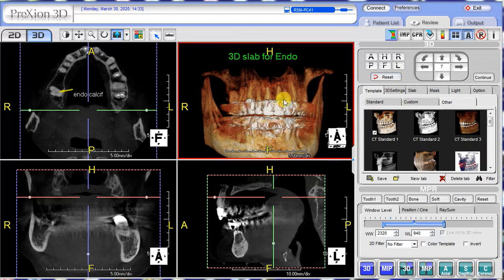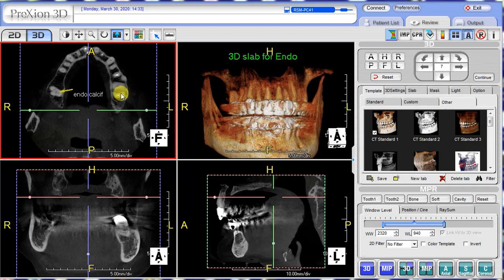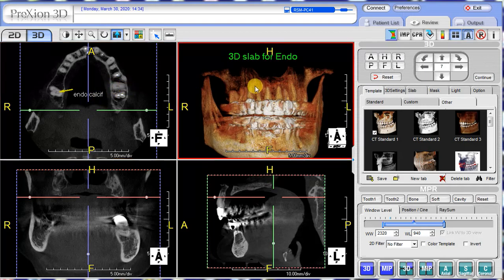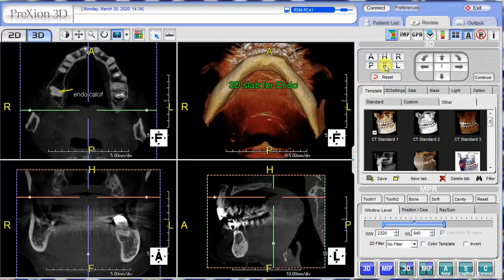Put the 3D in a foot projection, which is similar to what you see on the axial screen from the CBCT image. To do that, simply click the letter F in the upper right box and you'll get this axial view.